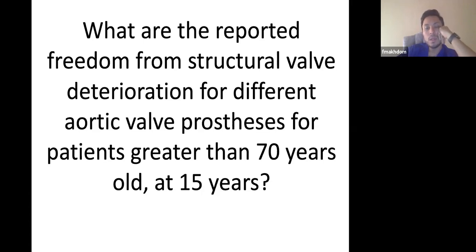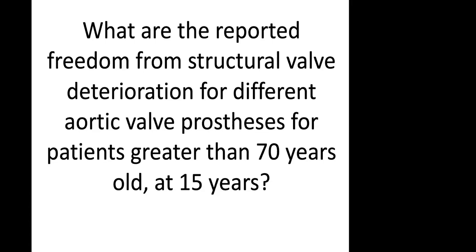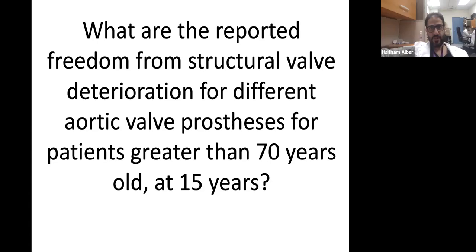What do you have to tell him? So actually, if he's 70 years old, there is nothing called zero structural valve deterioration in the aortic. We have mechanical valve and tissue valve. I will speak about tissue valve.